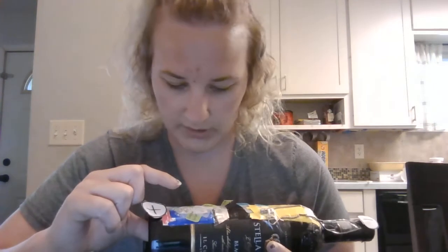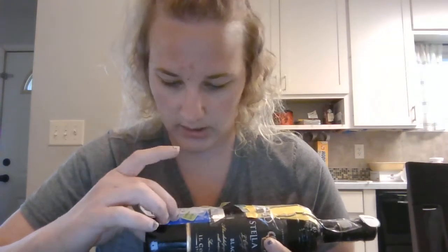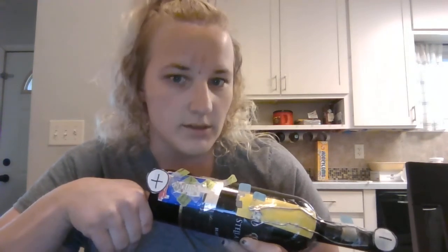The rotor, which was inside of the stator and inside of the envelope, is made out of a hollow copper cylinder and is attached to the anode disc by a molybdenum shaft. The cylinder is affected by the stator's electromagnetic field and thus causes it to start turning, as I previously mentioned. It revolves about 3,200 to 3,600 RPMs. The high-speed anodes can do about 10,000 to 12,000 RPMs.